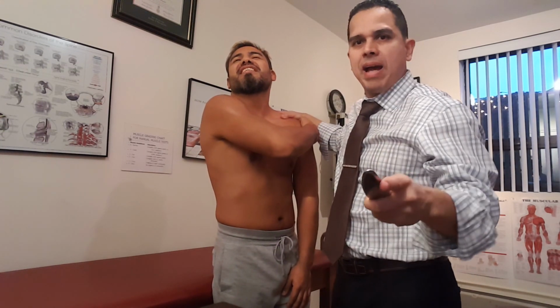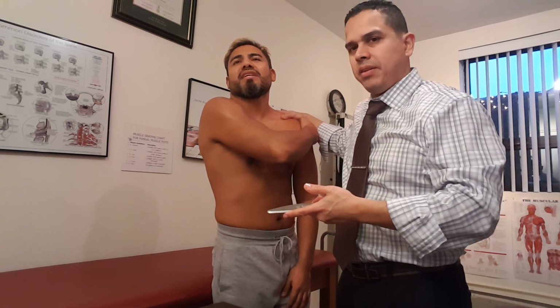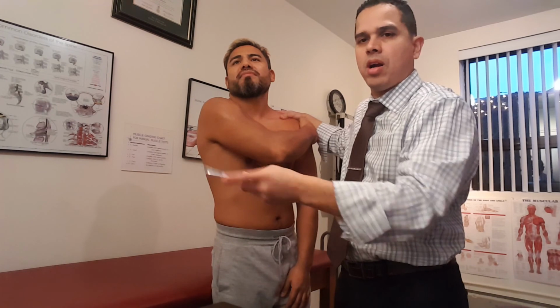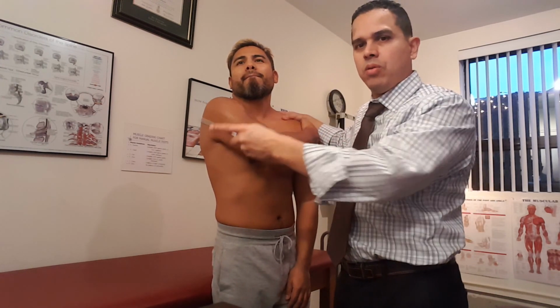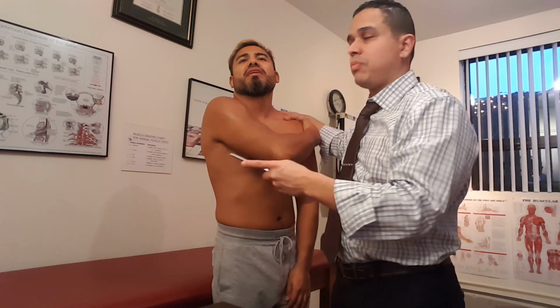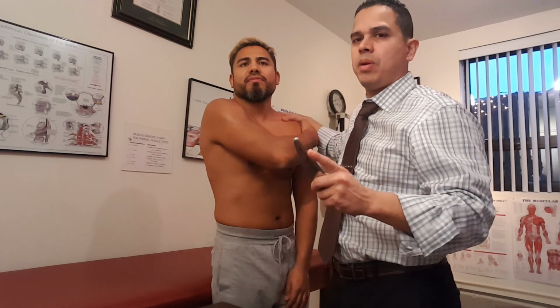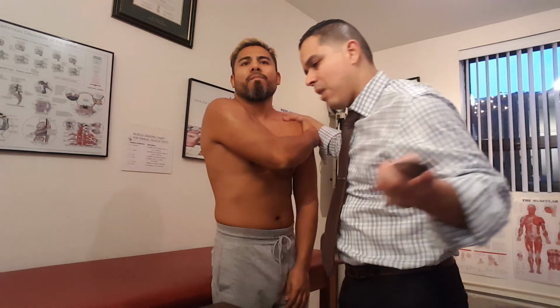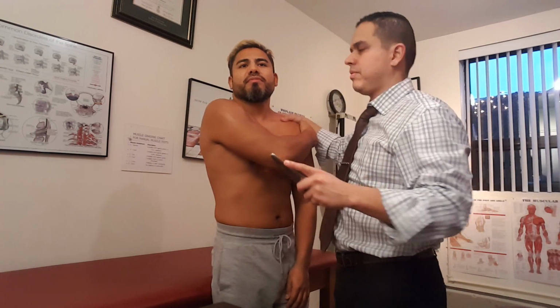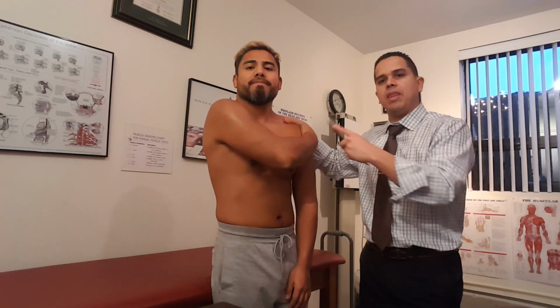All right. Active state. Back in the days, the way that therapy was done was very passive. So we just kind of lay you there and work on you. But we now know we get better results moving you, activating your muscles, especially in the direction where you're feeling pain. This is a big game changer in this kind of therapy. We have to take you through the course of where you're experiencing the pain. That way we can heal the muscle in that direction. That's why I'm doing this therapy now, while he's got his shoulder in this direction.